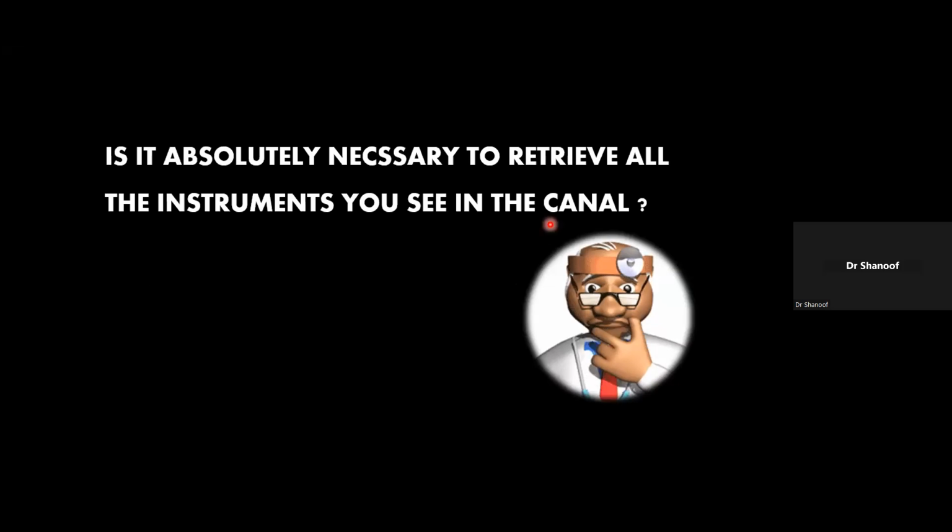So here one question arises. Is it absolutely necessary to retrieve all the instruments you see in the canal? So friends, you might have to free all the heads stuck in the grills, but you don't have to free all the instruments trapped in the canals.